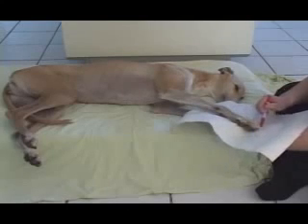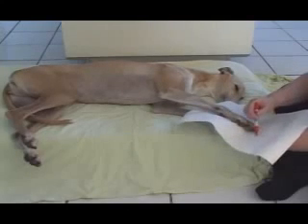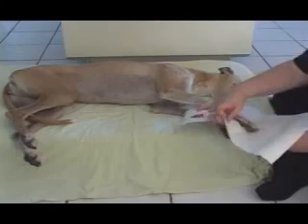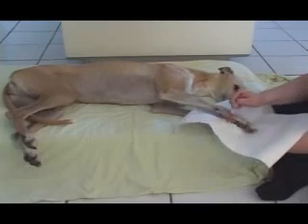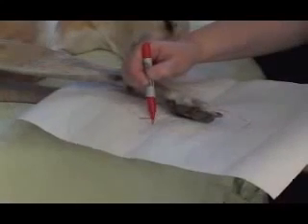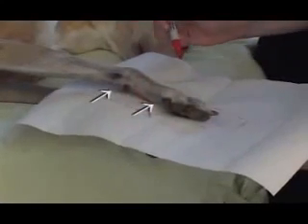Also, an extra inch or more of border should be left around the nails so that the edge of the splint can be curled up. This will prevent dirt and debris from getting into the splint. On each side of the paper pattern, mark the carpal joint and the proximal end of the main foot pad. Also, mark each side and the ends of the nails.